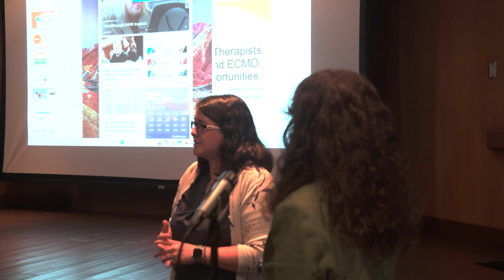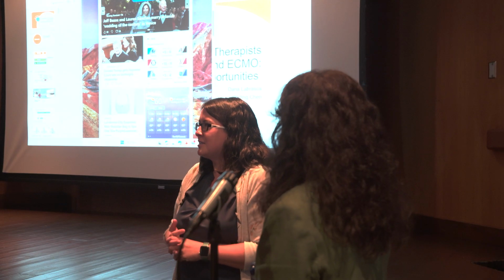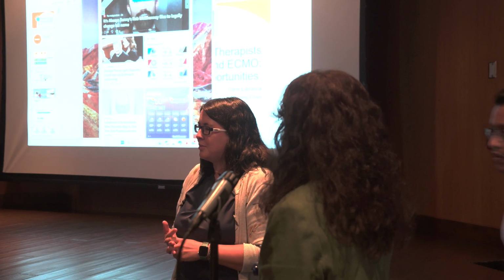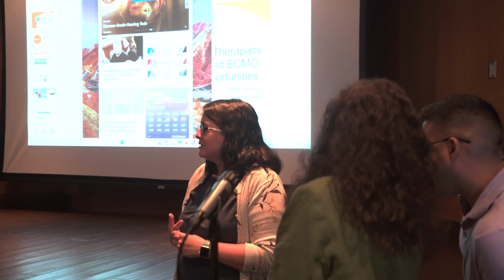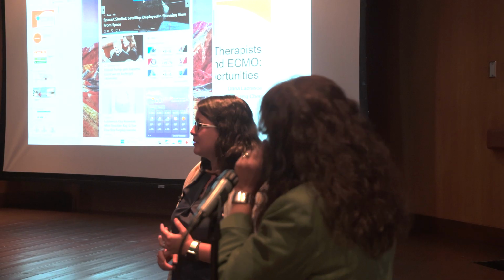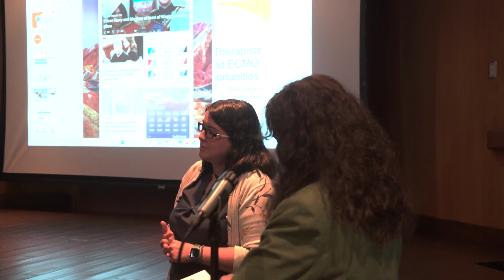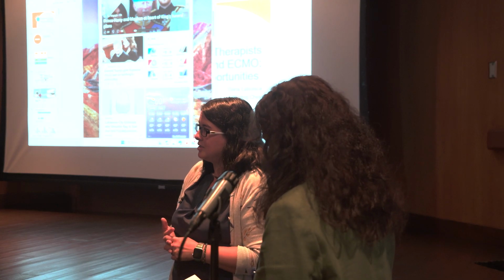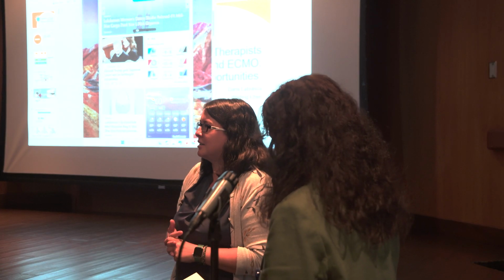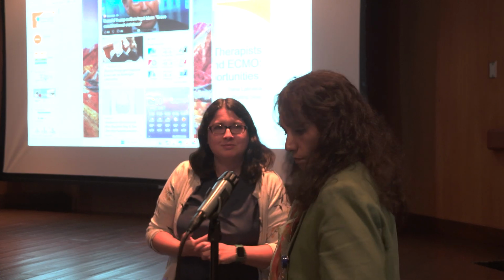I think on one of those graphics you guys saw, we only did 3 steps, which is actually really only necessary because the patient started to have about 46% collapse when we were doing that. But usually it's about once a day. It can kind of depend, like with the bronch case, if you create an intervention or the patient were removing a lot of fluid, maybe we can see if we could do another one with the patient. It just, again, kind of depends. Like if you have a patient status change, it might be advantageous to titrate that again. Good question. Thank you.